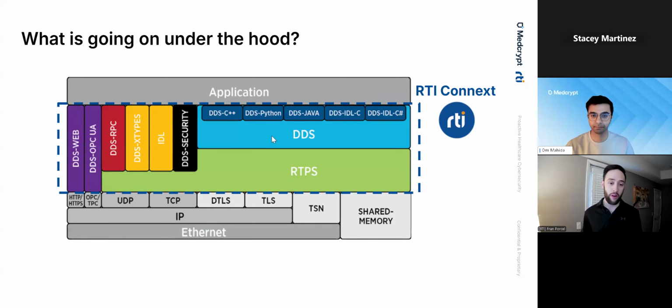And of course, very important here, we have DDS Security. With security, you're going to be able to secure your system. You could choose to use DTLS or TLS, or you can introduce security in a more fine-grained way, even over a transport that is not secure, over UDP, by securing this portion. This is the wire protocol standard within DDS. You're going to be able to very simply, with some QoS policy changes, secure the whole system with just some configurations and some certificates, obviously.